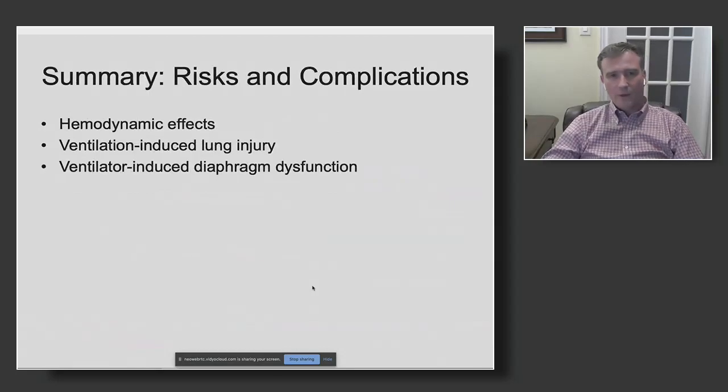Just to summarize, we have seen the hemodynamic effects of positive pressure ventilation and the risks of ventilator-induced lung injury and ventilator-induced diaphragm dysfunction. We want to keep these mechanisms in mind when we're applying the ventilator at the bedside. The key, I think, is to regularly monitor plateau pressure and P0.1 or POCC and the total PEEP in order to stay on top of the plateau pressure, the driving pressure, and the patient's level of inspiratory effort. Taking these things together will help you to ensure that the heart is not adversely affected and that the lung and the diaphragm are protected.